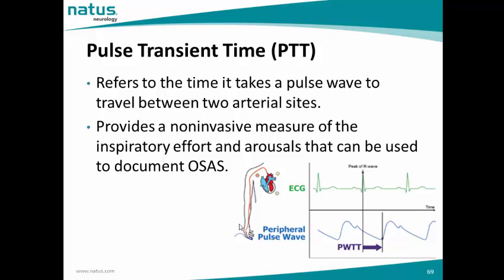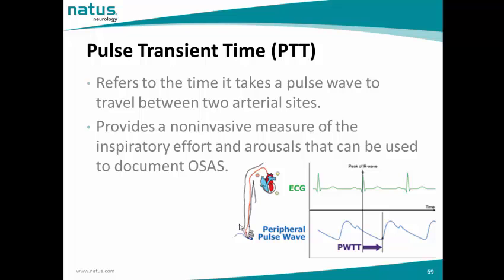Pulse transit time. It refers to the time it takes a pulse wave to travel between two different arterial sites, and it provides a non-invasive measure of the inspiratory effort and arousals that can be used to document OSAS.